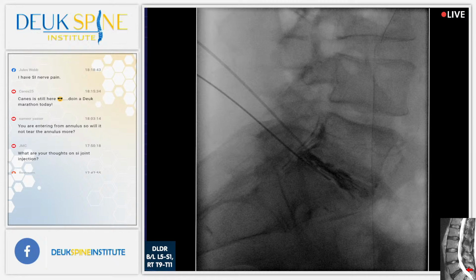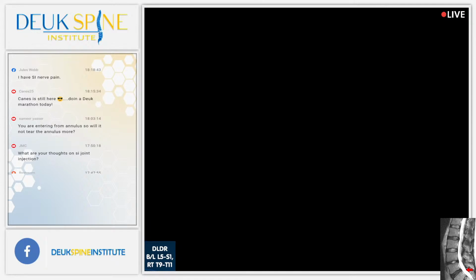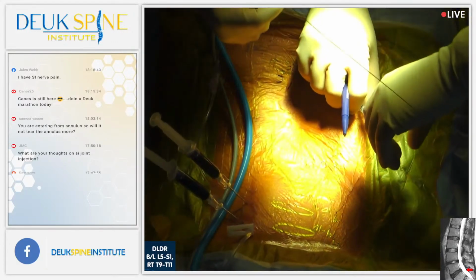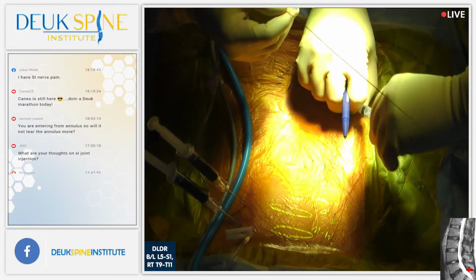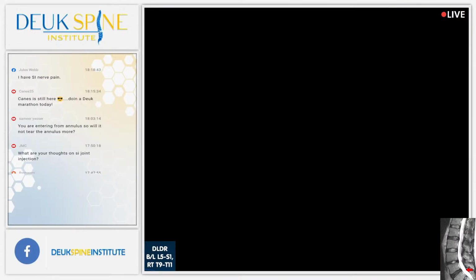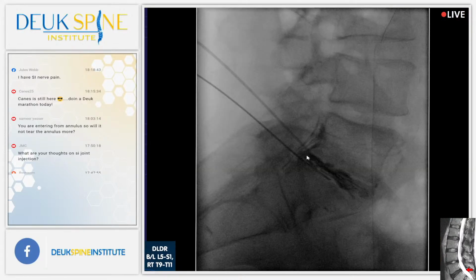Is that where you get back pain? All right, 11 over 10, concordant, L5-S1. Okay, head down for me. Jordan, show them the tear. So he's got a double herniation at L5-S1. He's got massive pain. We're not ready for this.